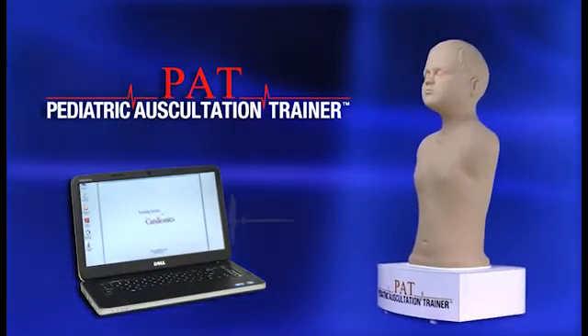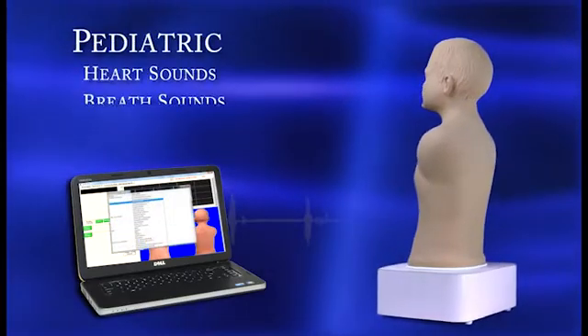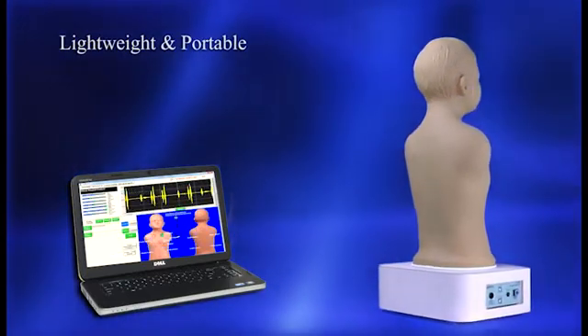PAT, the Pediatric Auscultation Trainer from Cardionics, is the latest innovation in teaching and learning critical pediatric auscultation skills and concepts. Weighing less than 20 pounds, PAT is portable and easy to use.